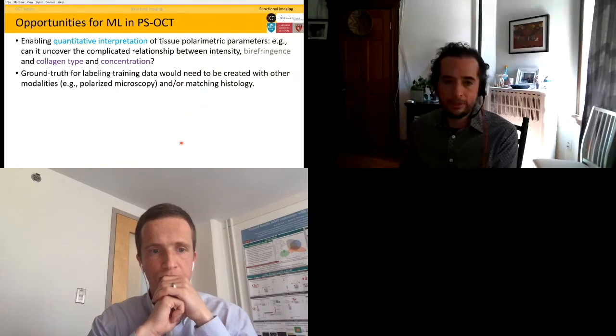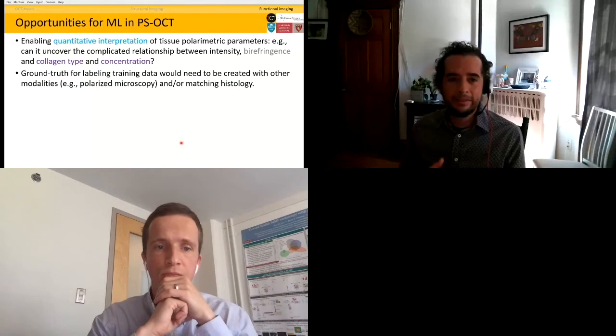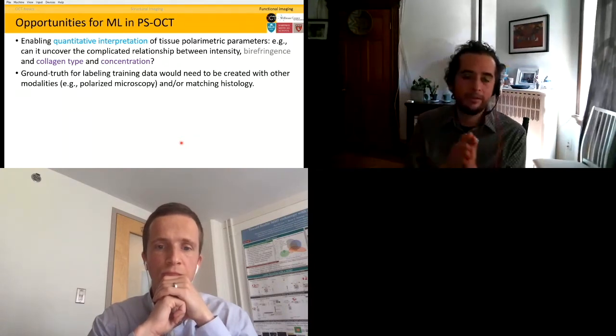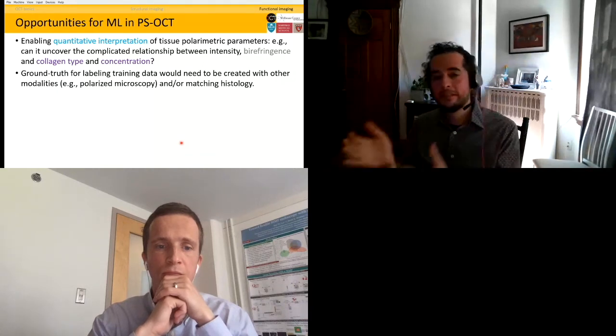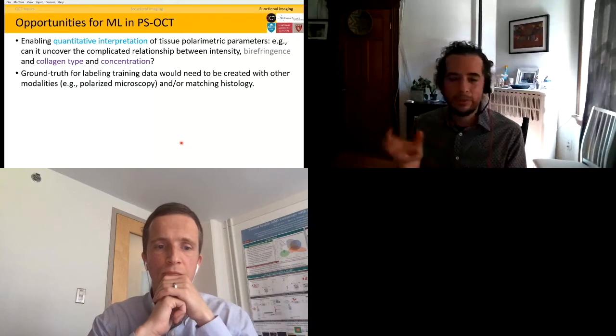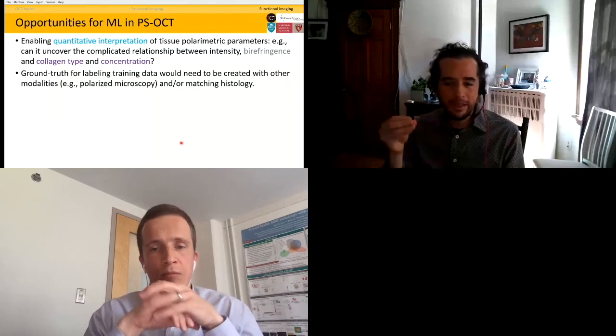Now, other opportunities for machine learning in PS-OCT would be, for example, to enable quantitative interpretation of these parameters that we get in tissue. At this point, I think it's more qualitative, in the sense that we can draw conclusions on whether there's presence of birefringence, whether it's high or low, but we are not really able to get metrics about density or collagen type.